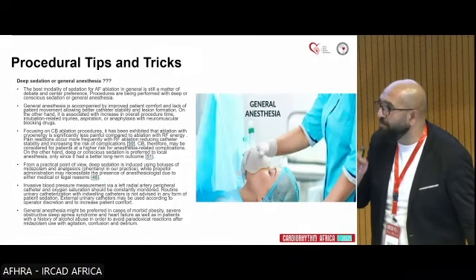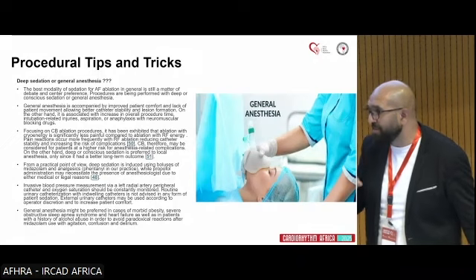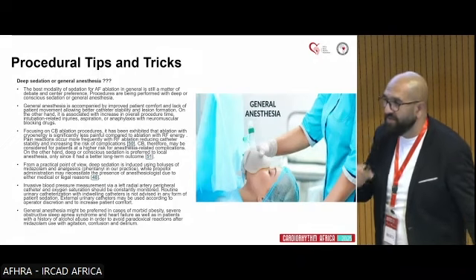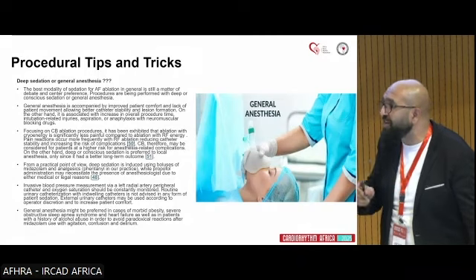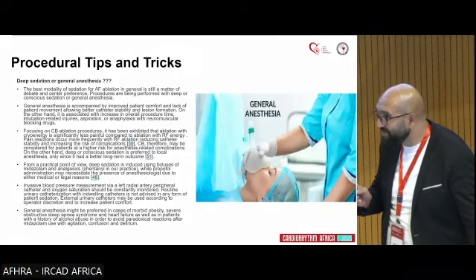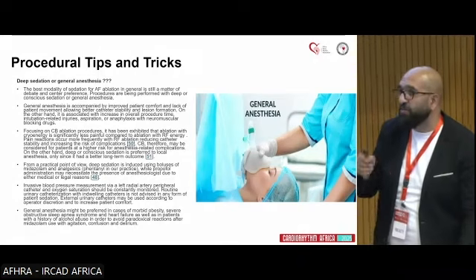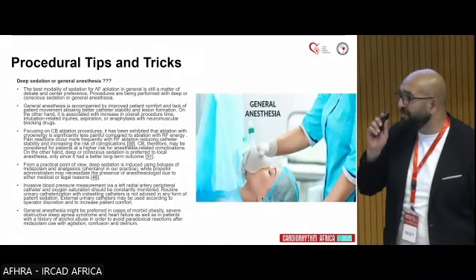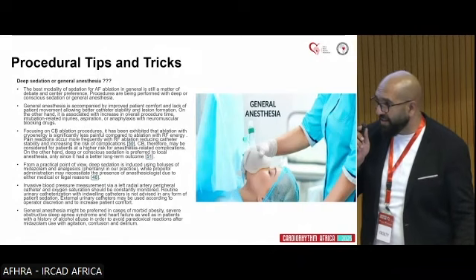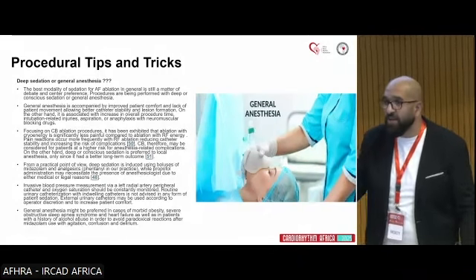It is very important. Why? If I give the patient muscle relaxant in general anesthesia and deep sedation, it will affect the phrenic stimulation. So I cannot stimulate phrenic during right superior pulmonary vein isolation. So the first thing is to ask the anesthesia not to prolong muscle relaxant more than 30 minutes.